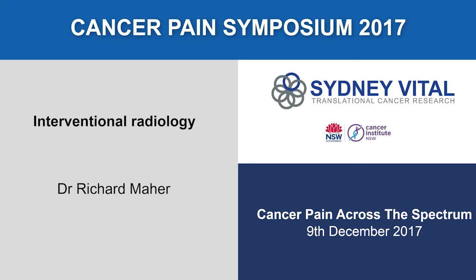Contraindications to ablation. As I said, it's collateral damage you need to watch out for. Adjacent to hollow viscera, particularly the colon, we're very nervous about. You can inject various agents to push the colon away, such as dextrose. You can infuse dextrose and give yourself a few centimetres. RF is limited by size, so when the lesions are greater than 3 centimetres, we prefer other tools such as microwave or cryo, and obviously proximity to spinal cord is an issue.